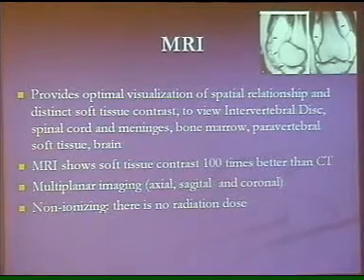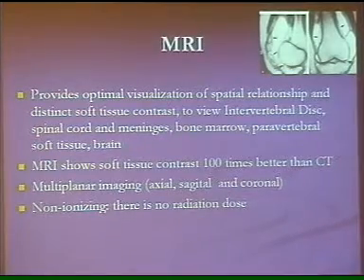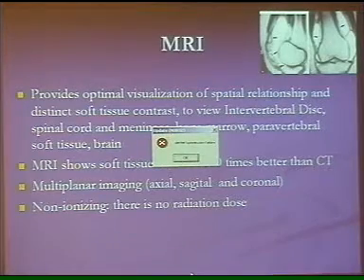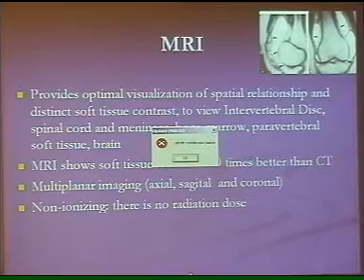So the same is here, and the main advantage is there are no radiation hazards. The only hazard is if there are some metallic parts on your body, and sometimes patients with a phobia of lying down in the tunnel. But these days, open MRIs are available.